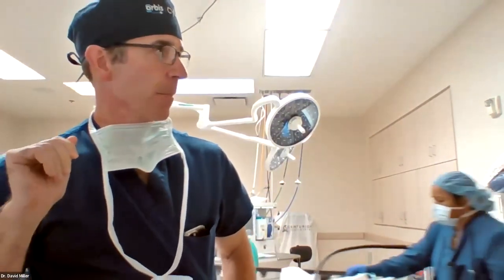We actually do enough of these that we keep a whole consignment of all the powers here. You can always order these one off. I actually work at Children's Hospital too in Akron doing retinal surgery, and we've placed this exact same lens in some pediatric patients, ages 10, 8, and maybe as low as a 6-year-old, who for whatever reason cannot tolerate an aphakic contact lens and needed a lens implant. And this has worked very well for them too.